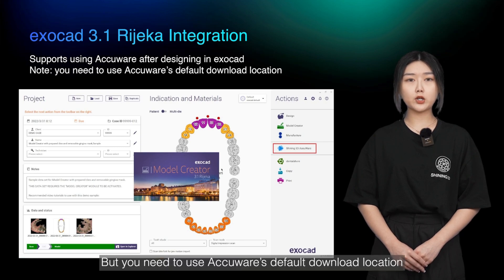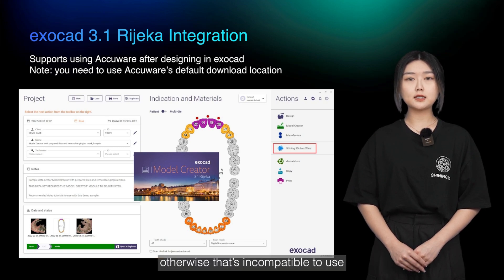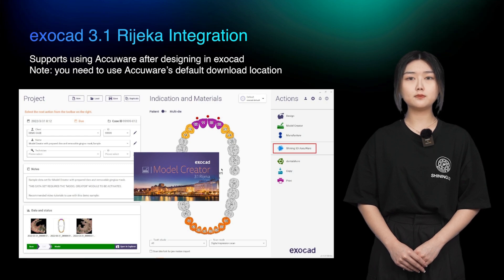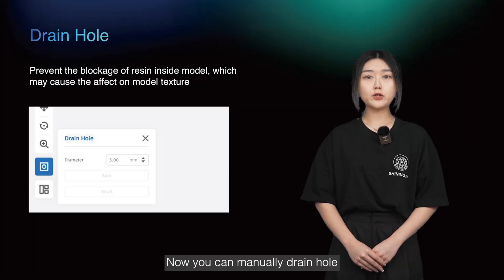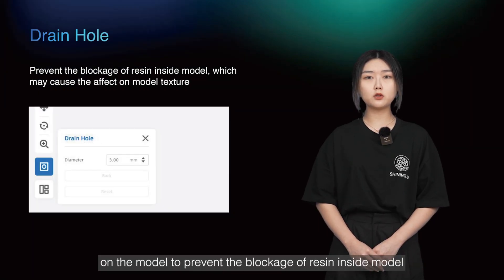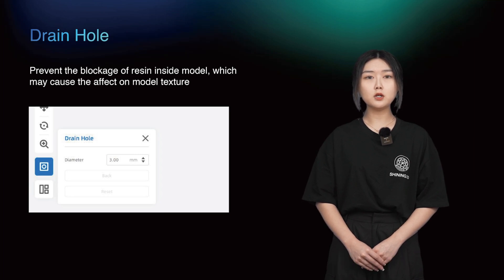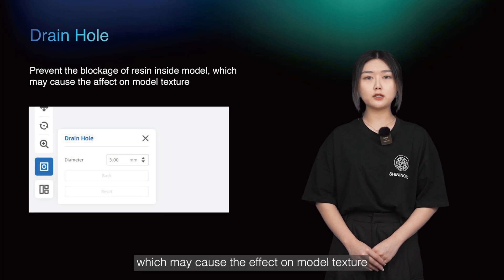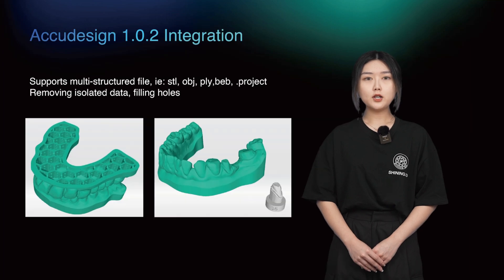You need to use AccuWare's default download location, otherwise it is incompatible to use. Now you can manually add drain holes on the model to prevent blockage of resin inside the model, which may cause an effect on model texture.